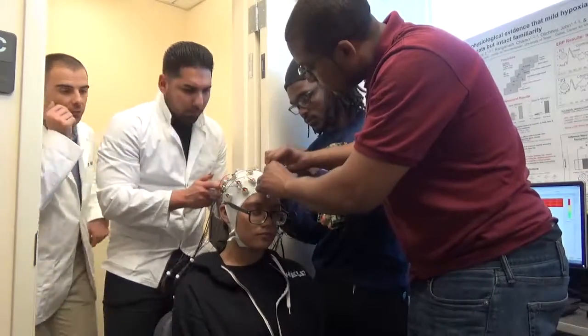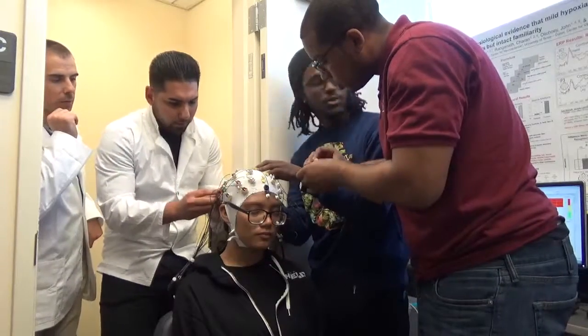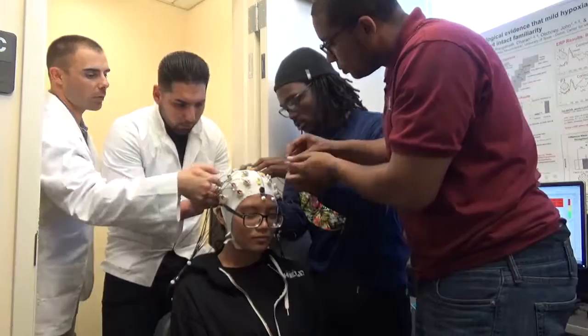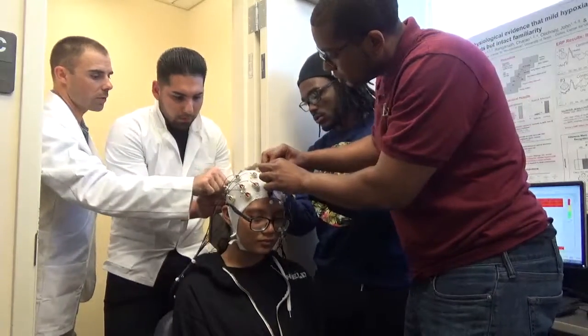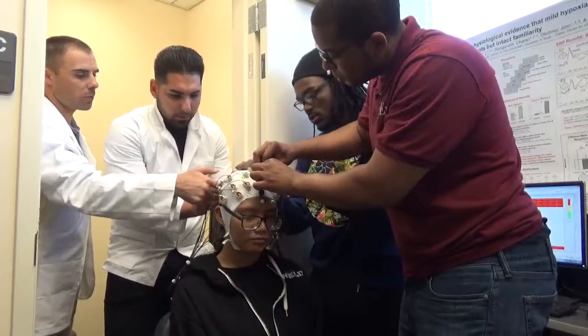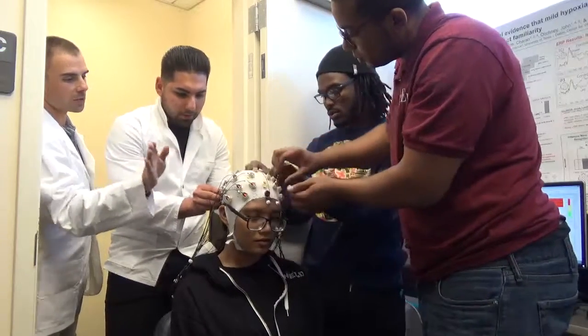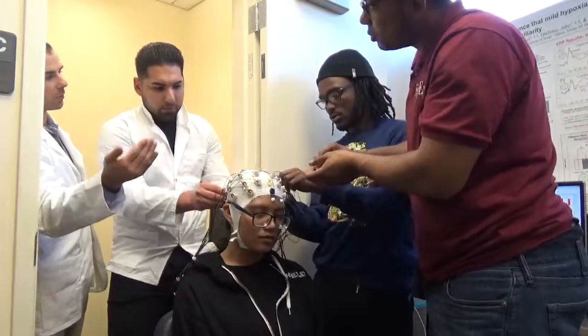Okay, so are they all plugged in? Almost. You're all red too. Supposed to. So you don't want to pull it out. You want to push it in. So you are pulling the plastic piece off the head. Okay. You don't want to do that. You want the plastic piece on the head because you just put all that gel there. You don't want to pull all that off.